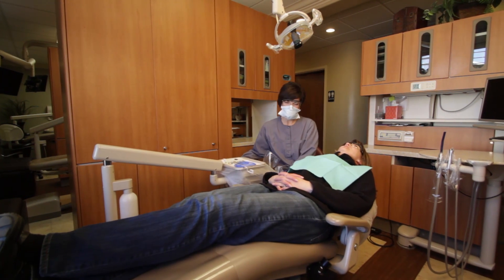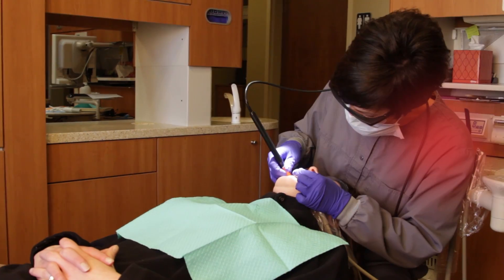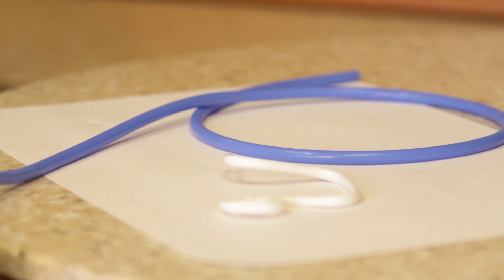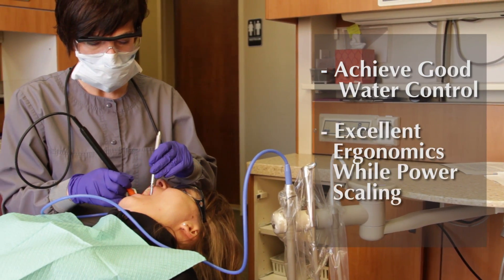Water evacuation with an ultrasonic scaler can be challenging, and with poor ergonomics can be painful. But with the BlueBoa adapter, you will achieve good water control and excellent ergonomics while power scaling.